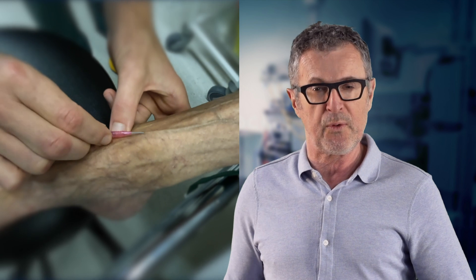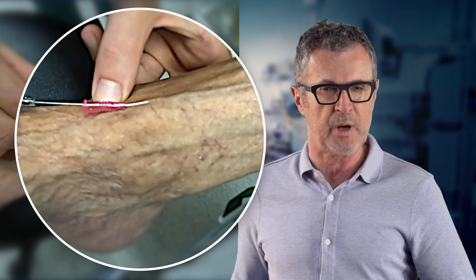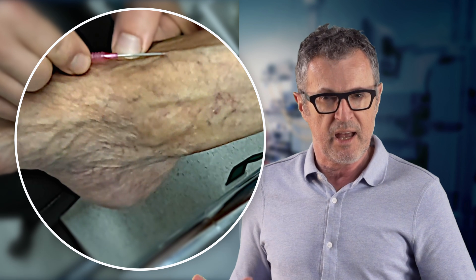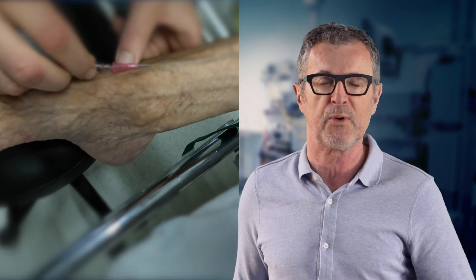In particular, the video will focus on what to do when the veins in the foot are thick-walled, and what to do when they roll — the two most common problems that can make IV access in the foot difficult, very painful, and inconvenient for the patient.